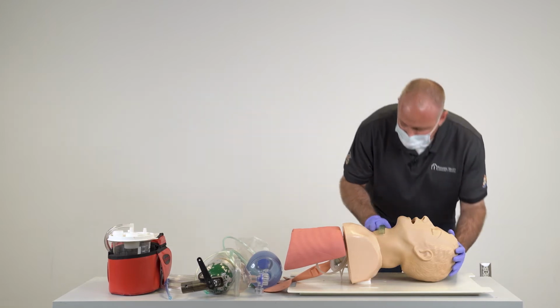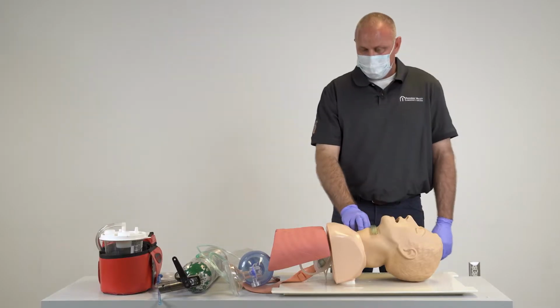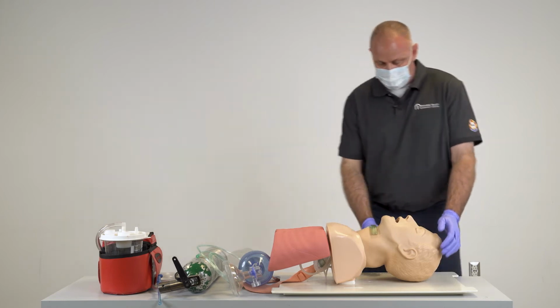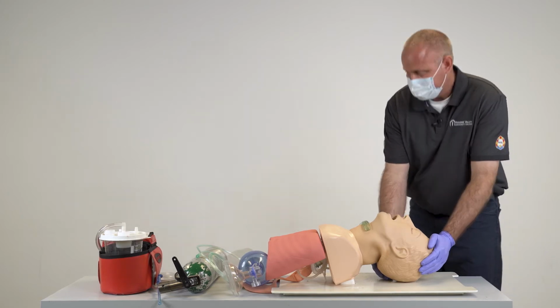Now I want to look, listen, and feel for no more than 10 seconds. The patient is unresponsive, apneic, and has a weak pulse of 60. Okay, I'm going to go ahead and open my patient's airway. Do I see anything in my airway? The mouth is full of secretions and vomitus.